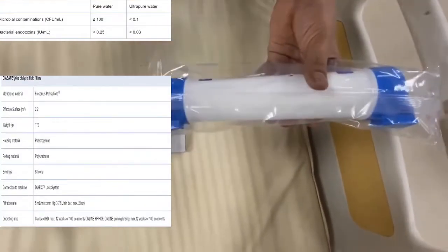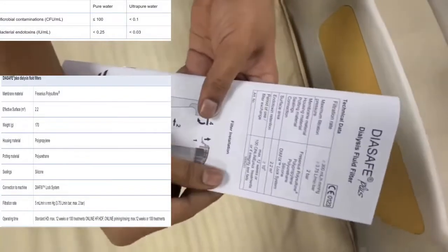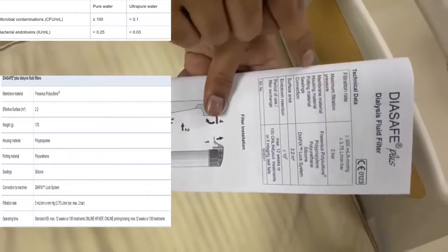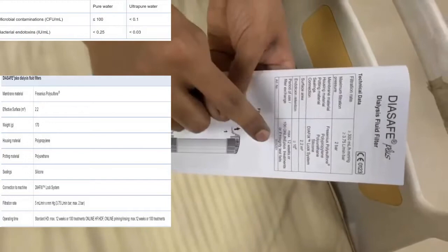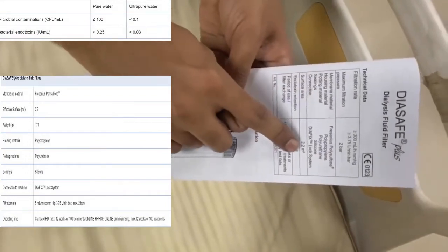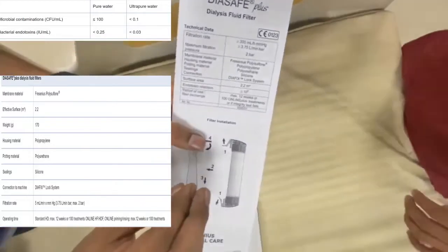Even though the water used for dialysis is being purified by the RO plant and various steps, this is the final checkpoint to produce ultra pure water. Ultra pure water basically reduces chronic inflammation, oxidative stress, and improves the response of erythropoietin to anemia, and also reduces advanced glycation end products.